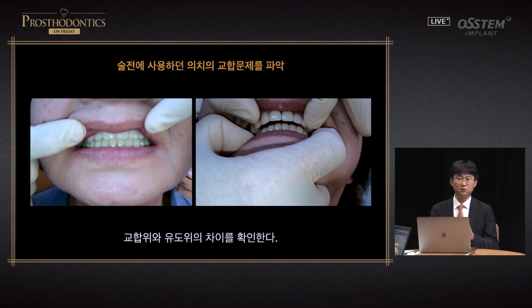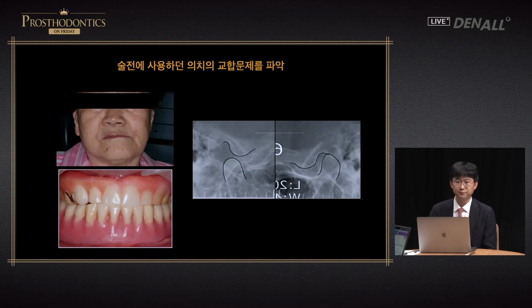So I try to modify the denture a little bit. Usually, if you make the mandible a little bit flat like this, the mandible will find a stable position, and if you modify a little bit of the denture, bite taking can be made easy for the final denture, and the ability of the occlusal position can be checked, so it has many advantages. Unlike young patients, in many patients we find it is difficult to determine stability just based on the joint status.